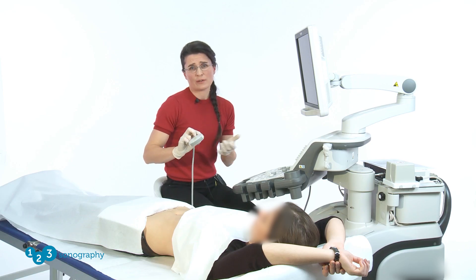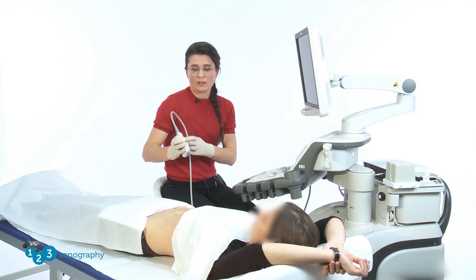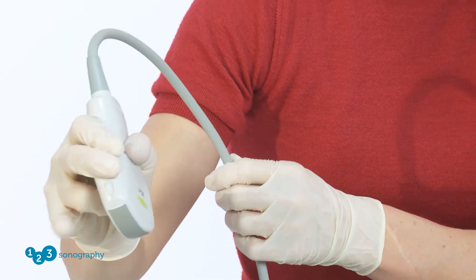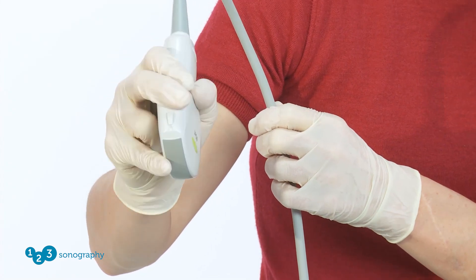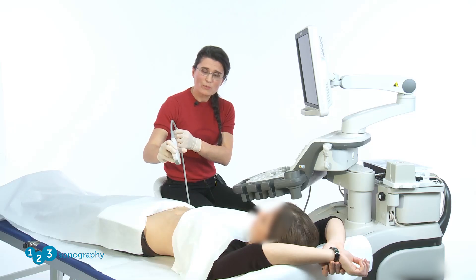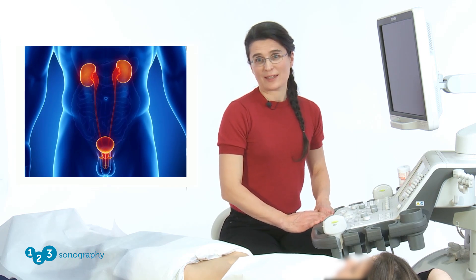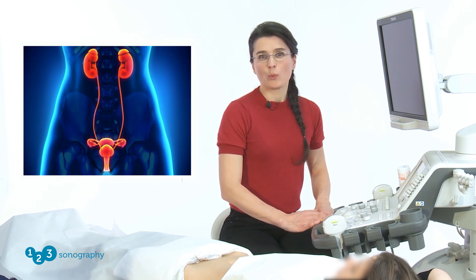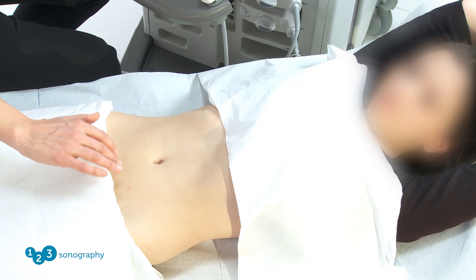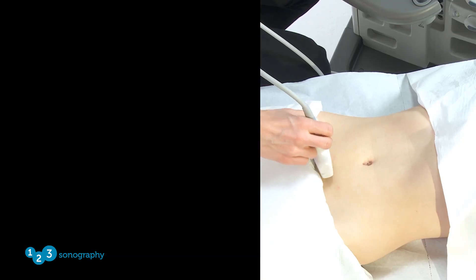Now, how to hold the transducer — there are several ways, and I'll show you our way. It's important to have enough stability and good contact with the body of the patient. I hold it near the nose of the transducer, not near the cable, so I can apply the pressure I need. I hold it like a pencil because I can stabilize it, and it's light enough that I can do the movements I need — tilting or moving the transducer. So, where do we find the urinary bladder? Before performing an ultrasound, it is helpful to imagine the position of the bladder in the body. We find it in the lower abdomen behind the pubic bone. We get two positions of the transducer: a transverse position and the sagittal position.